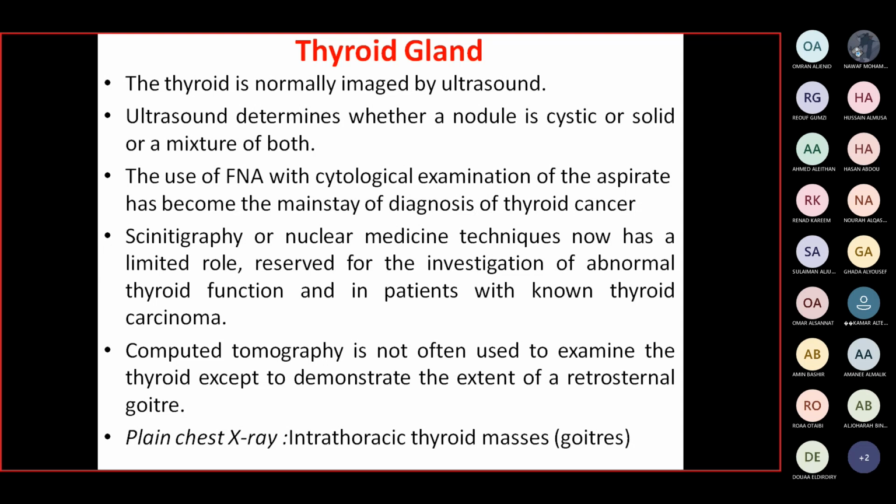Nowadays, to diagnose thyroid malignancy, the FNA must be done, and this FNA is done under guidance of the ultrasound.